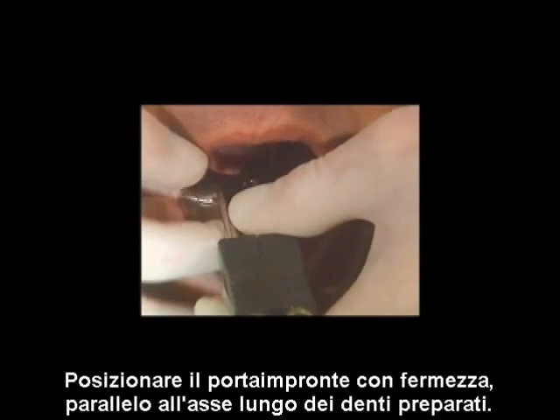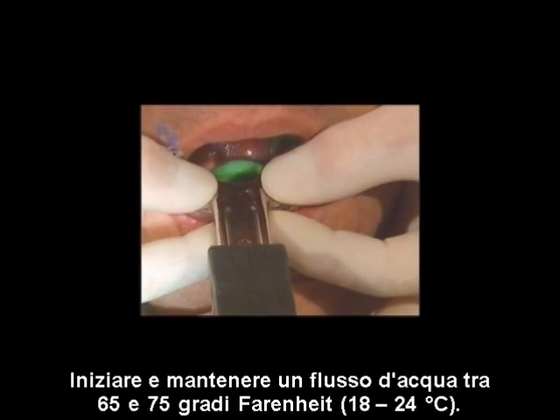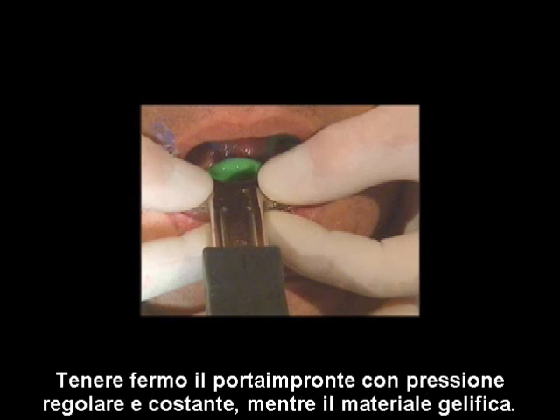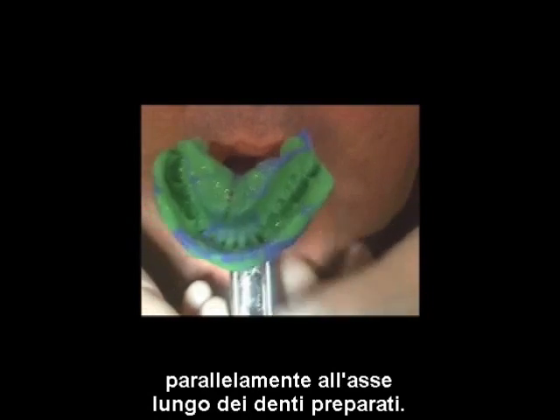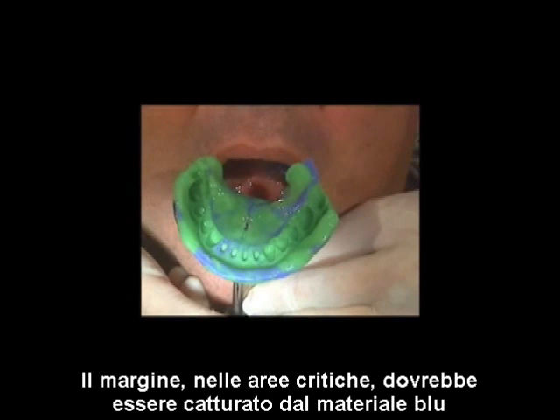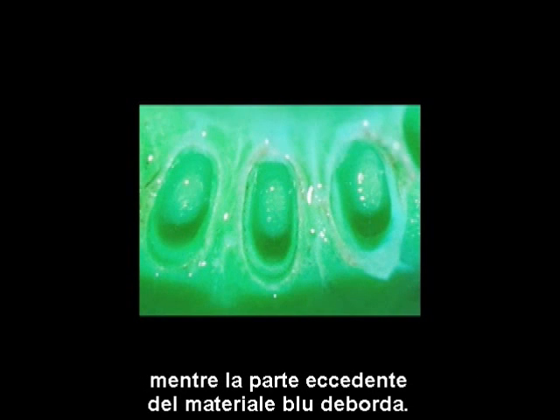Seat the tray firmly and deliberately, parallel to the long axis of the prepared teeth. Initiate and maintain a 65 to 75 degree Fahrenheit flow of water. Hold the tray with steady, even pressure while the material gels. After five minutes, remove the tray with a deliberate snap, parallel to the long axis of the prepared teeth. The margins and critical areas should be captured by the blue material, with the remainder displaced from the site.